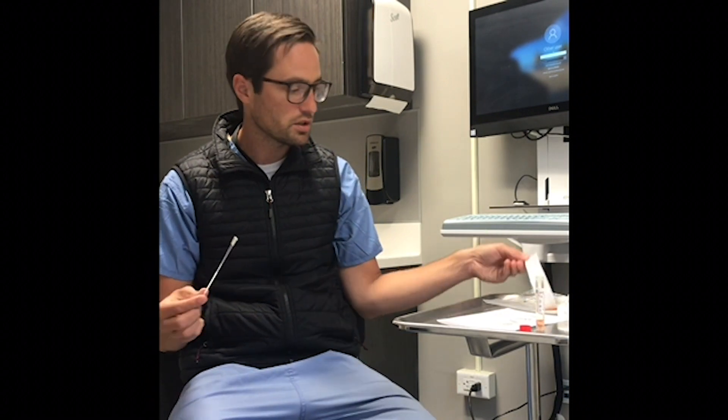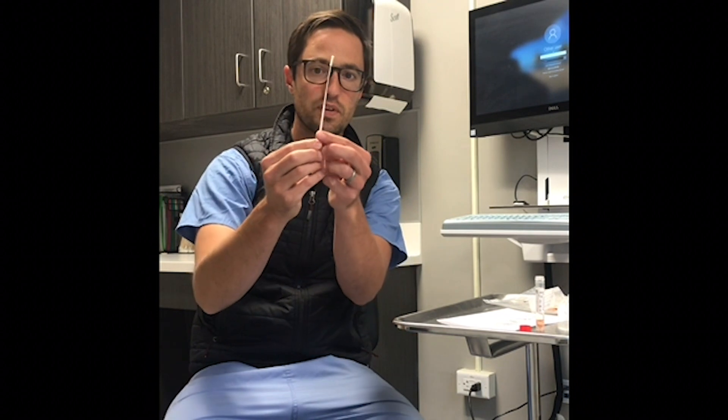Try not to touch the cotton end of the swab. About two-thirds of the way down the swab is a red line with a small score there. Keep your fingers below that score line if possible.